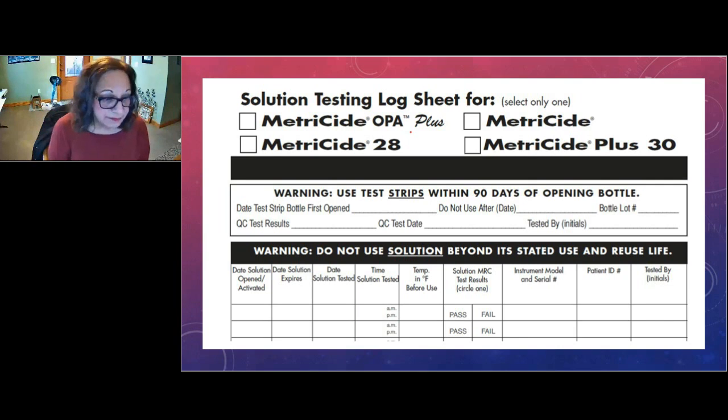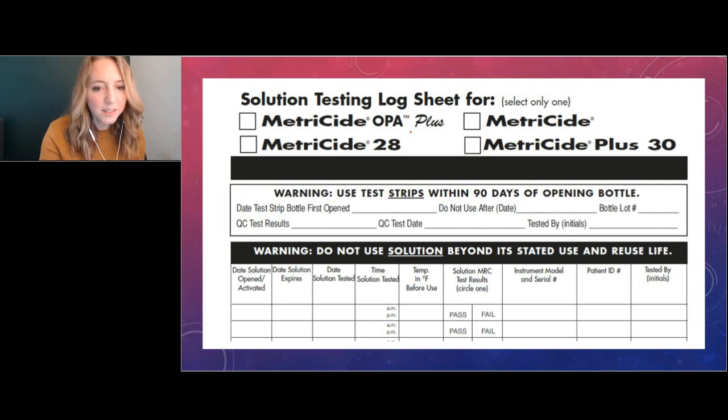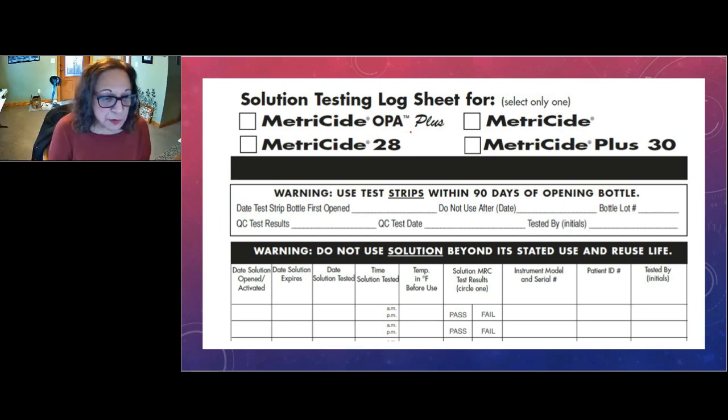Next question. This next question says, could cold sterilization be effective for plastic dental instrument sterilization? That would truly depend upon the instrument manufacturer's directions for use and what they say you have to do to be processed.